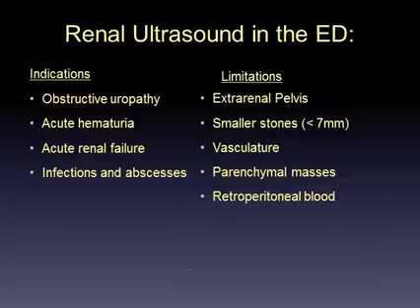to distinguish those. Masses can have a very similar echogenicity to surrounding normal tissue, and the ultrasound in the ED is particularly insensitive to locating those. As with anything in the retroperitoneum, retroperitoneal fluid is difficult to identify on a simple bedside scan.